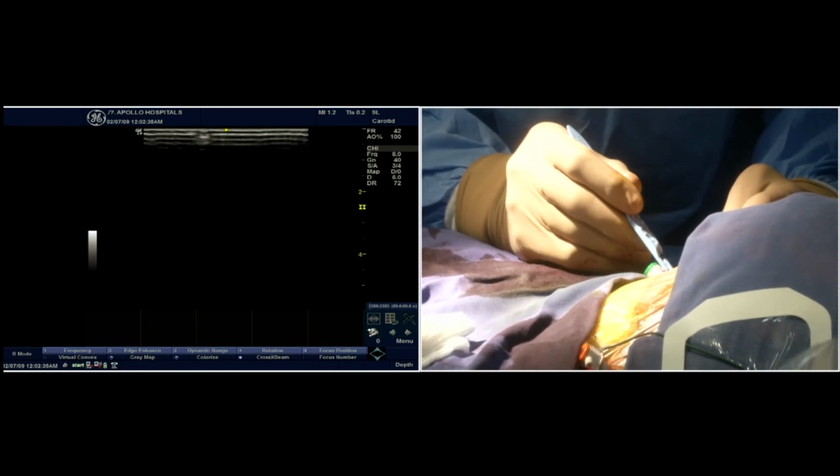Of course, with experience, and for people who are doing a lot of femoral cases, in the majority of cases, you will not need this kind of approach, but it's very important to be sure that you are doing the puncture above the bifurcation and below the epigastric artery, because the risk is very high if you go too high or too low. And sometimes the safe zone can be very short. So that's why in this kind of situation, the pigtail approach can be very useful.